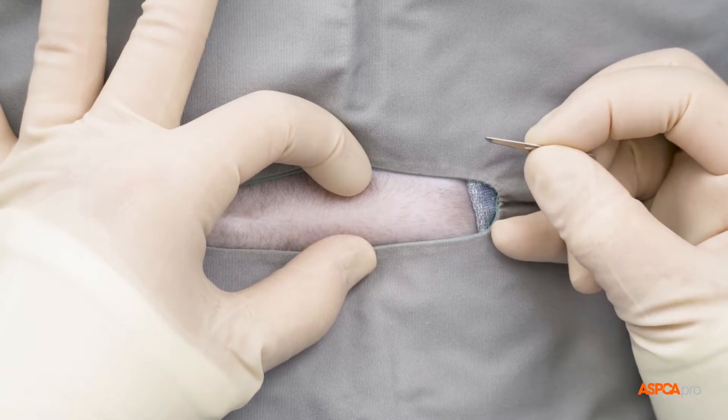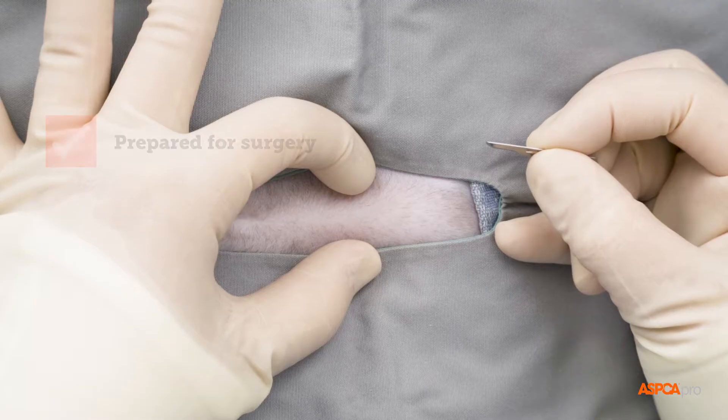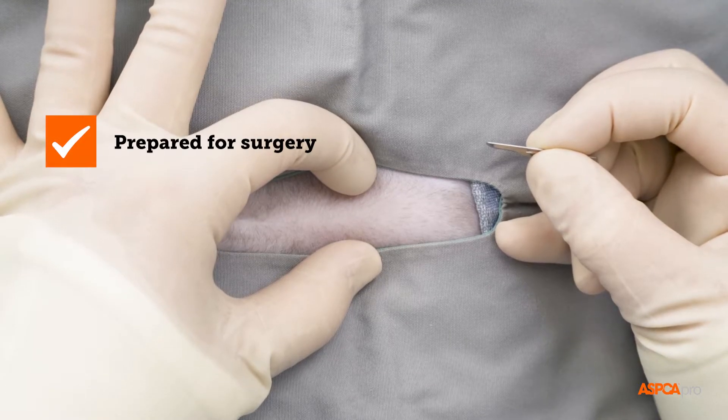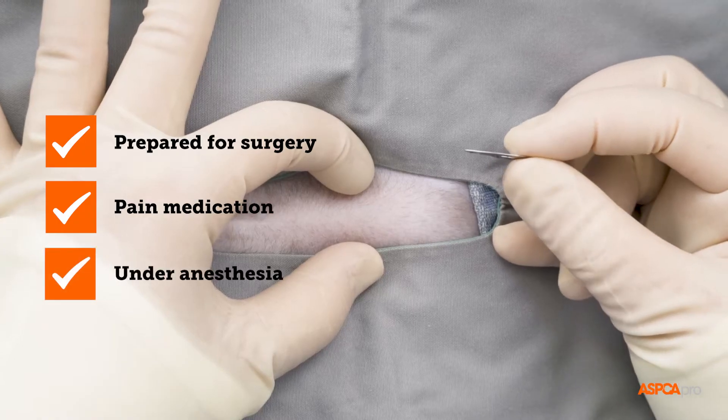Spaying a cat means removing her ovaries and uterus. Surgery begins once the patient has been prepared by veterinary support staff, been given pain medication, and is at an appropriate plane of anesthesia.